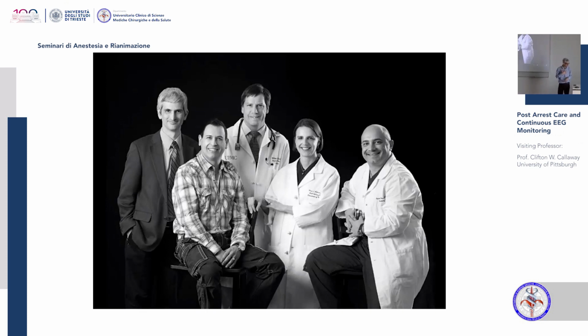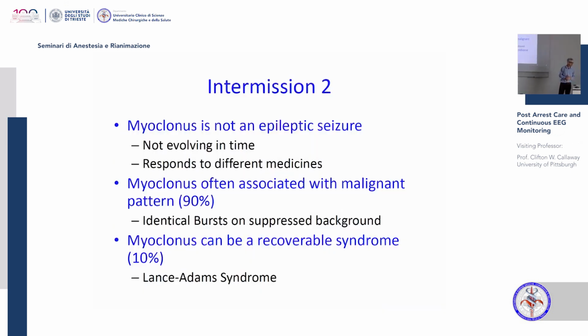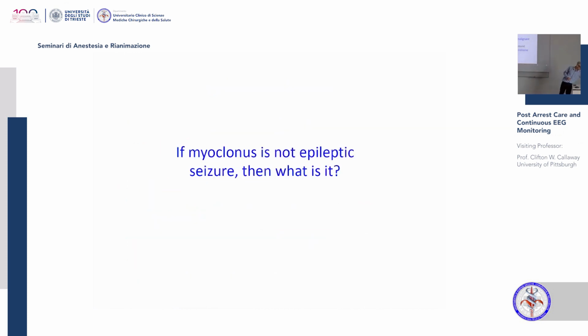And I am certain that I have not saved some patients who could have survived. It's not a seizure. It's not epileptic seizure. It's often bad news when it has those identical bursts and suppressed background. But sometimes it's not bad news. So hopefully that's something that many of you will take into your practice.